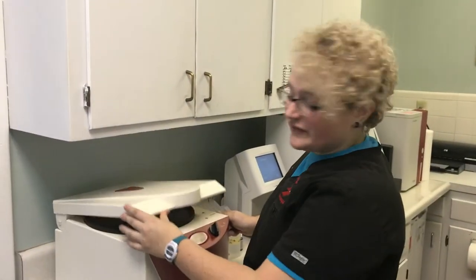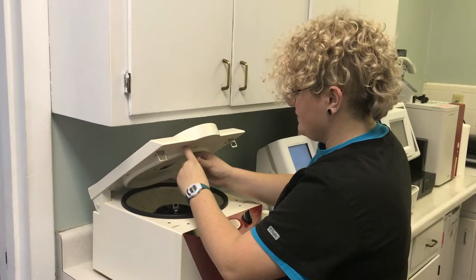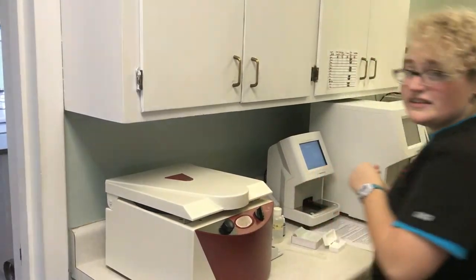Now that my tube has spun for 5 minutes, I'm going to go ahead and take it out of the centrifuge. Then I'm going to pour out the supernatant into the sink.